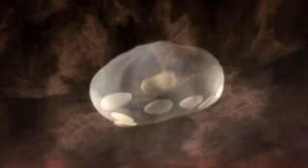Pre-osteoblast cells passing by are drawn to the adherent protein layer. The cell's attachment points move, making themselves available to the adhered proteins at the surface. Where high protein concentrations are present, there are more attachment points, and so the cells are attached at a faster rate and in higher numbers.